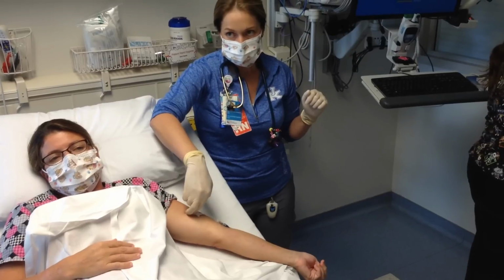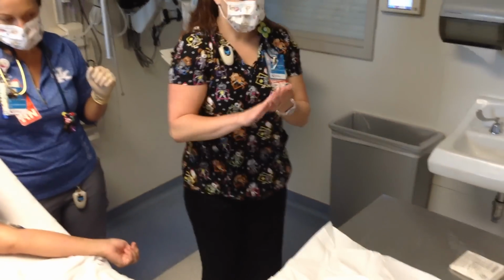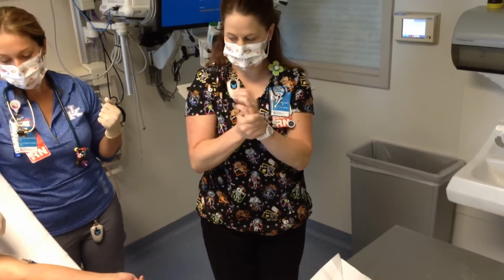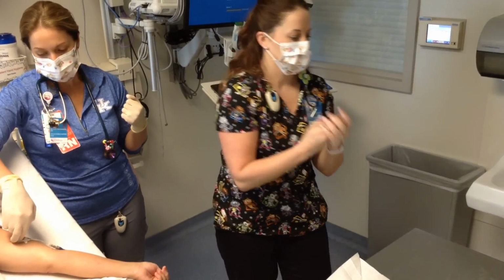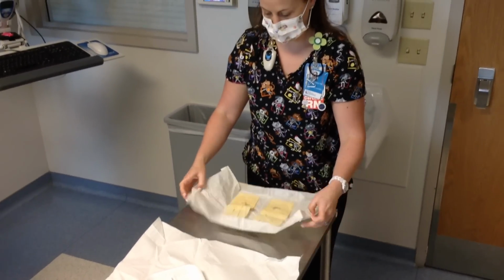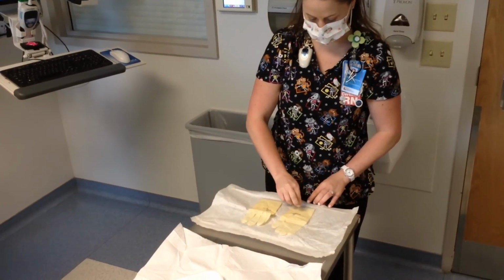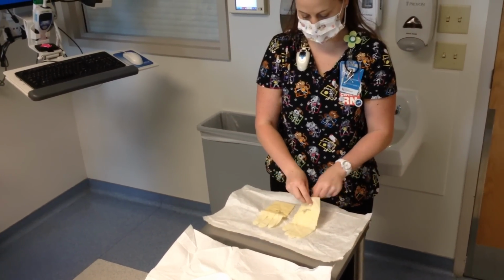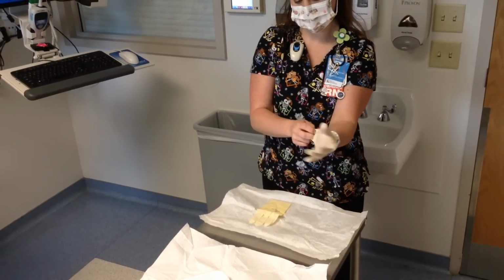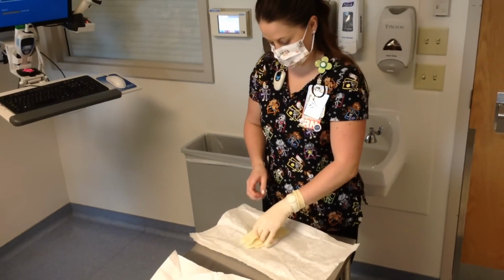So now Renee is going to remove her gloves and perform hand hygiene again, and put on some sterile gloves. And she will arrange and organize supplies on her sterile field. You want to arrange the field so supplies are easily accessible. Cut your steri strips, open your bio patch, tear your tape measure if you want to, and separate your gauze.